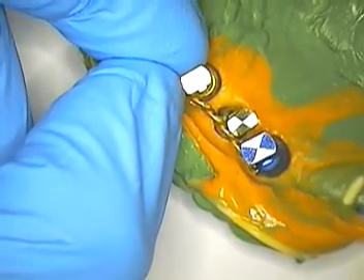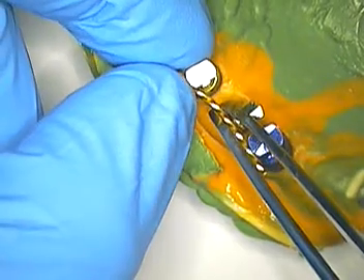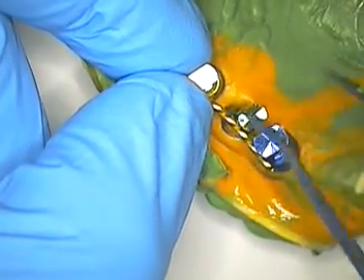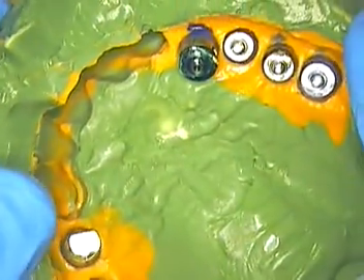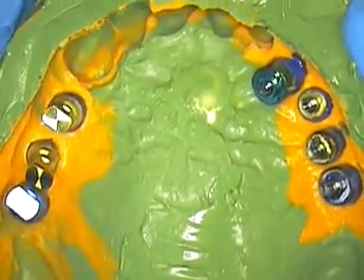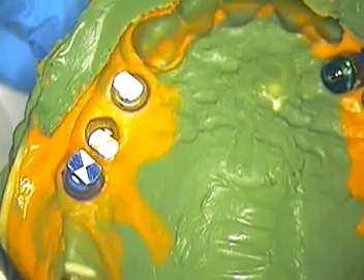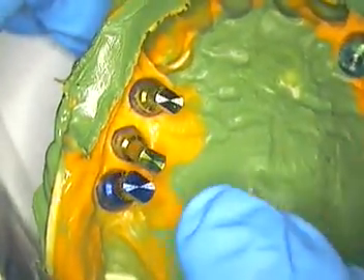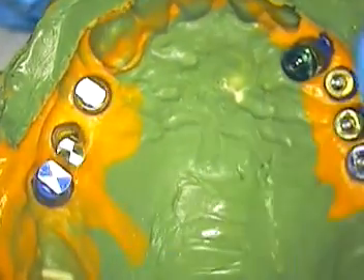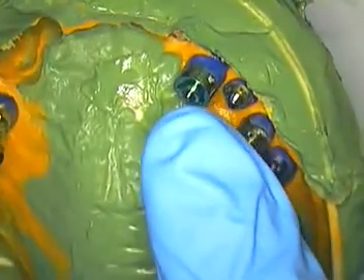Hello and welcome back. This is Dr. Jerry Cuomo. I'm here this evening in my office finishing up the day, and I wanted to video record how I would assemble this screw retained implant case. As you recall, earlier we took an impression with an open tray designed to pick up a total of seven implants — all Nobel BioCare implants. We transferred the soft tissue emergence profile, the EP, to the impression coping and made sure we had enough room interproximately to allow for a sluiceway and embrasure space for the patient to keep clean. The most difficult one was number six.